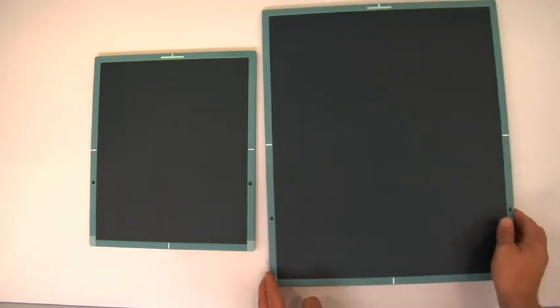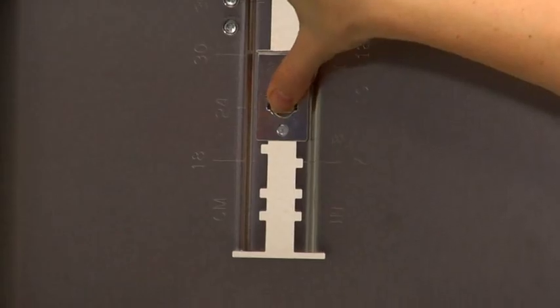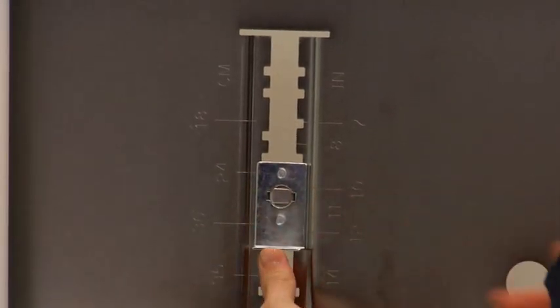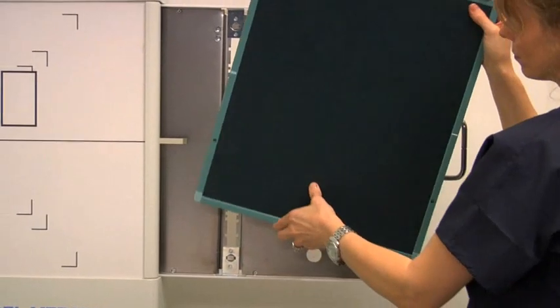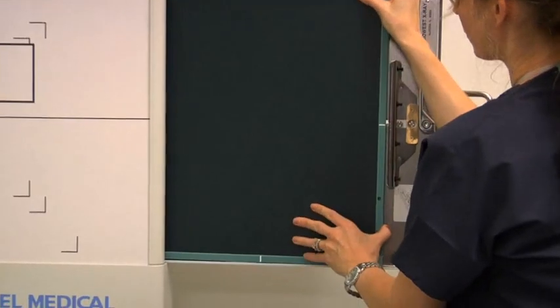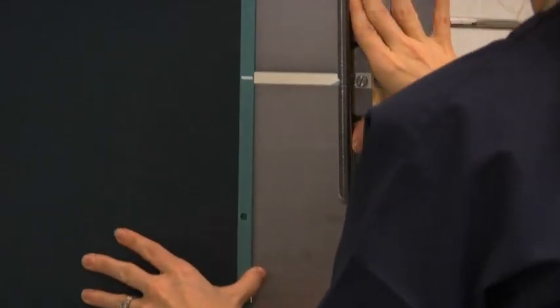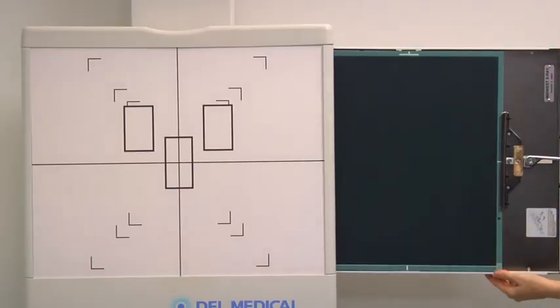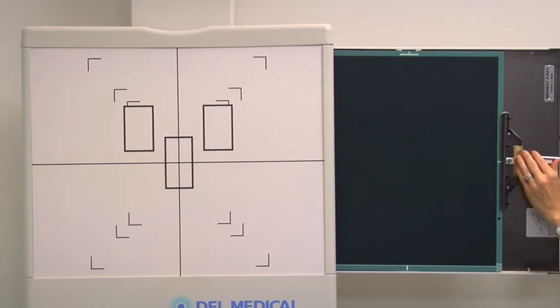Image plates can be of varying sizes. The most commonly used sizes are 10 by 12 inches and 14 by 17 inches. Inside the bucky cassette tray is a measurement guide to help ensure the proper positioning of the cassette. Once a cassette is correctly placed in the middle of the tray, it must be locked into position so that it does not move during the exposure. Most bucky trays contain a lever to lock the cassette in place.